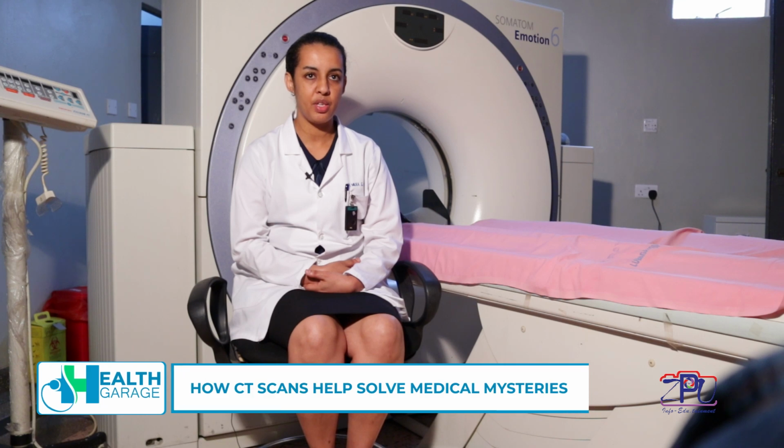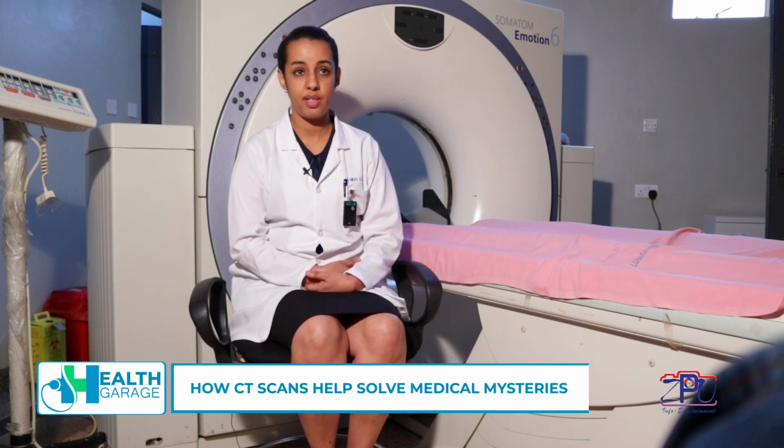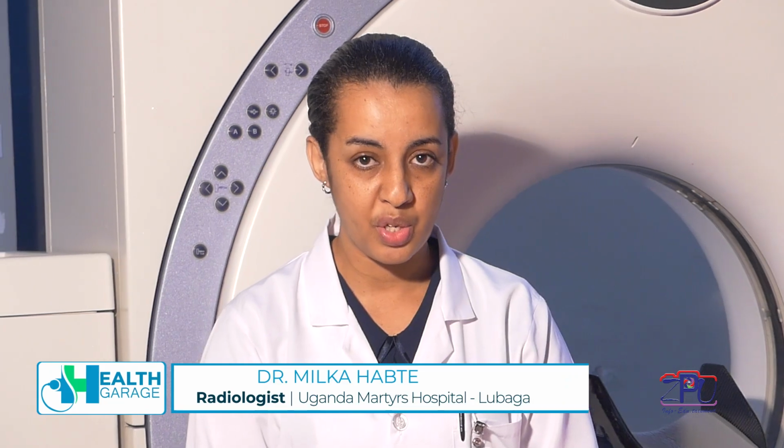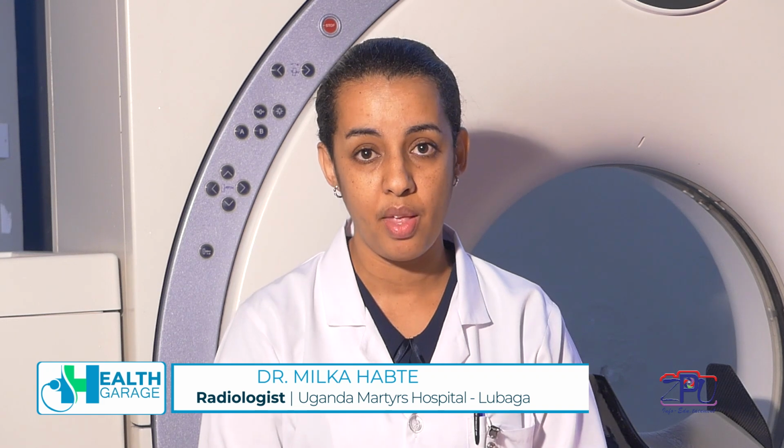CT scan procedures are used for emergency and non-emergency cases. Patient may have, for example, a trauma to the head and maybe bleeding inside the head. So in that case, that may be emergency, and the patient has to be brought to the radiology department for a CT scan as soon as possible. So treatment or measures are taken on time.